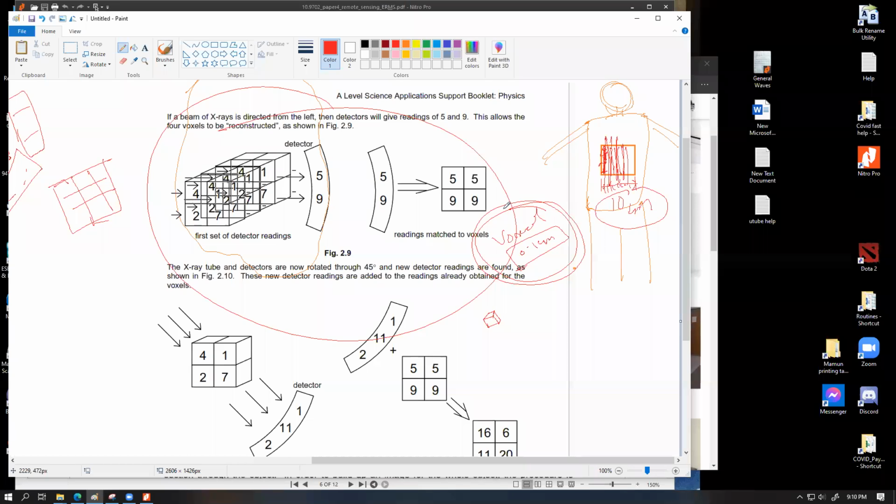But let's say you are trying to find a large grown-up tumor. You might not require that small a voxel size, because you know that the tumor physically exists there. You might be feeling it from the outside. You just want to know exactly how big it is, or how deep it is within the tissue where it grew. Then maybe the doctors can increase the voxel size. So depending upon what we want to scan, we can change it, but the changes we bring will definitely affect the amount of data that we have to handle.